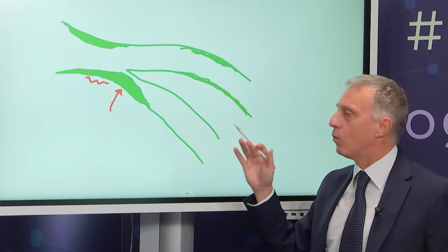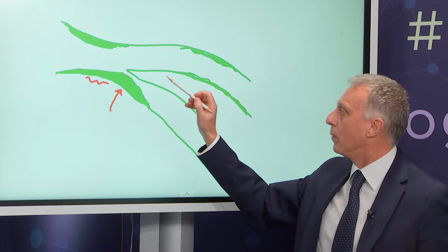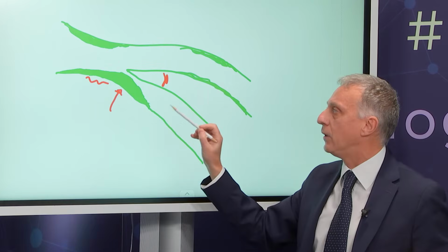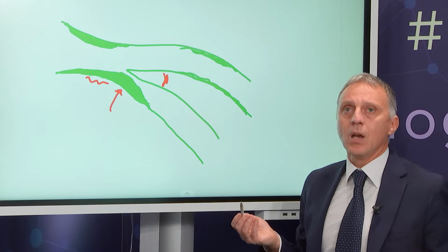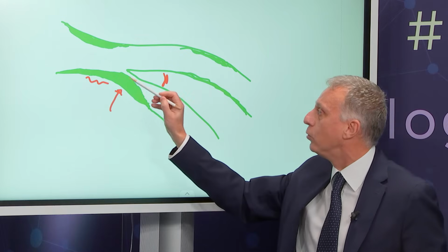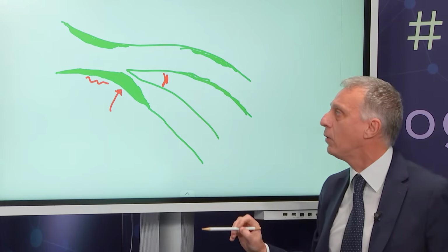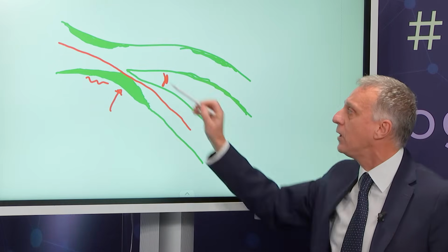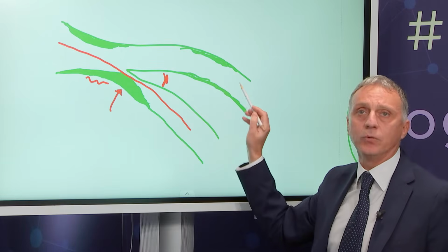So overall, what I think is that the coupling between this acute angle and this plaque distribution really calls for the use of a provisional approach, not trying to fix the ostial lesion with a stent just put down, and using this as the main operative vessel, since plaque is more distributed in this axis as compared to the other one.